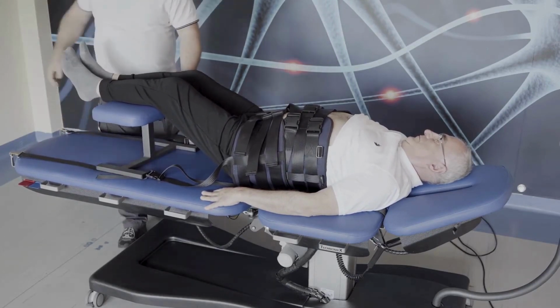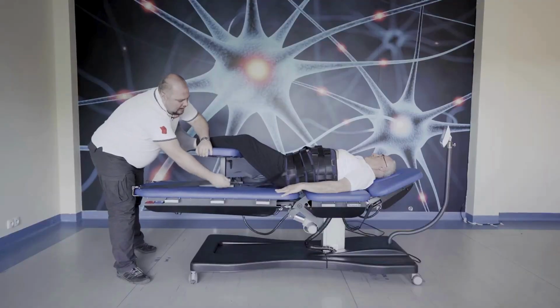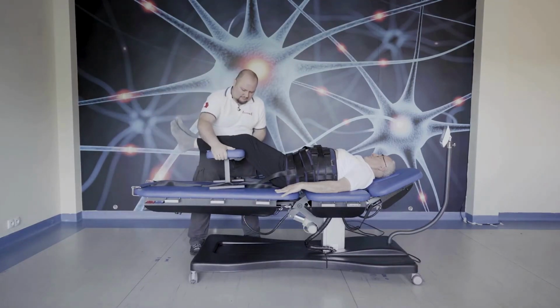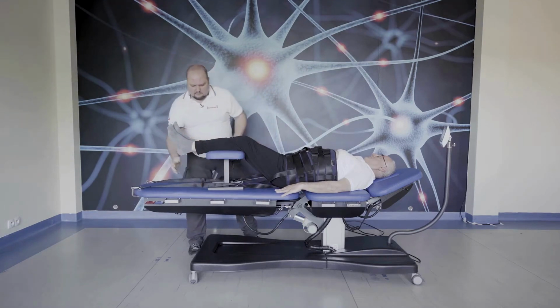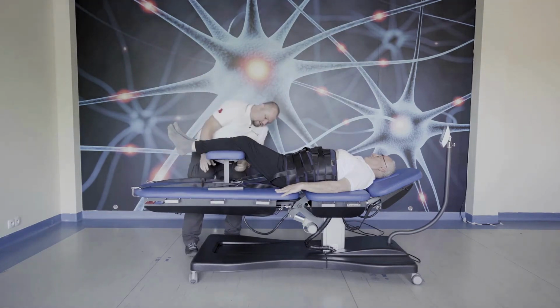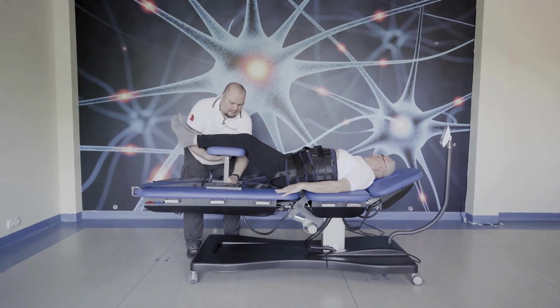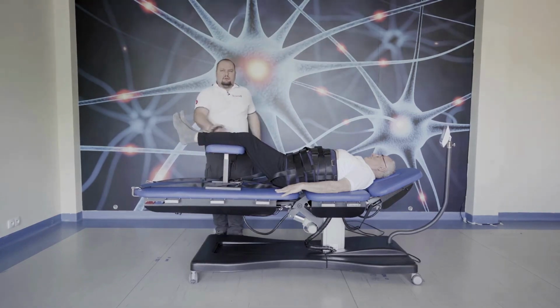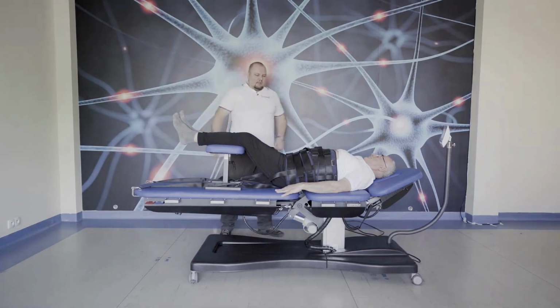But you must remember to have all strips above the chair. And we may adjust the height of the patient's legs using the adjustable part of the chair.